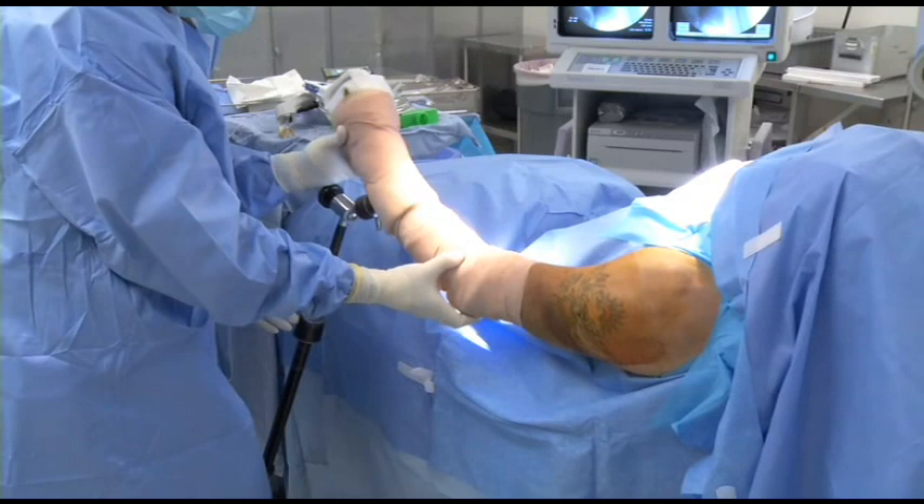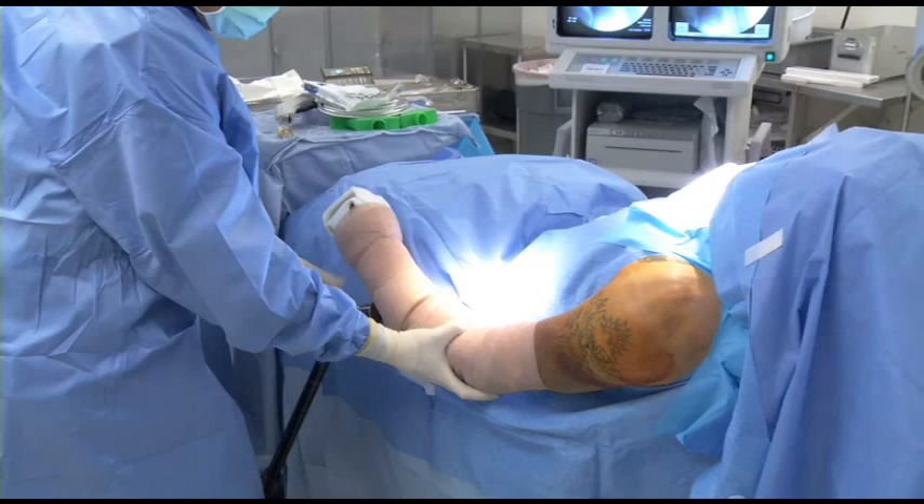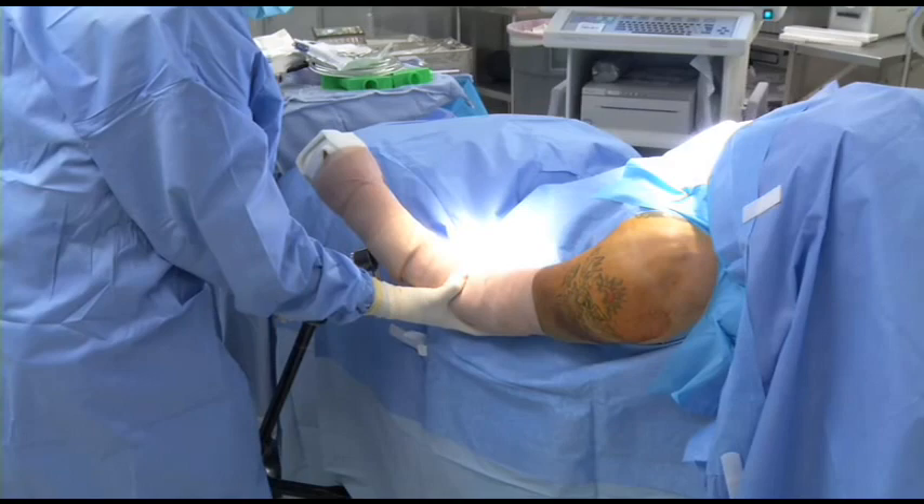A little bit of extension facilitates putting the nail in. The key is to keep it in neutral rotation and a little bit of extension.